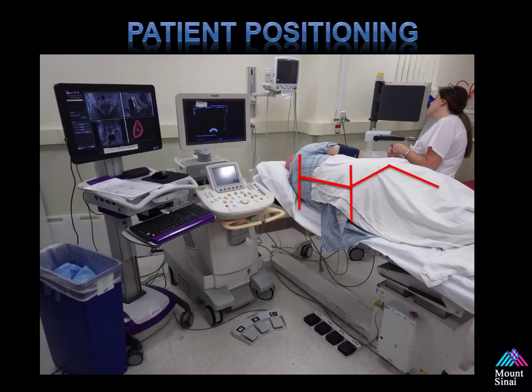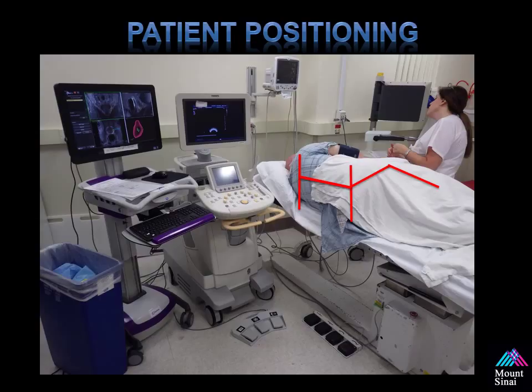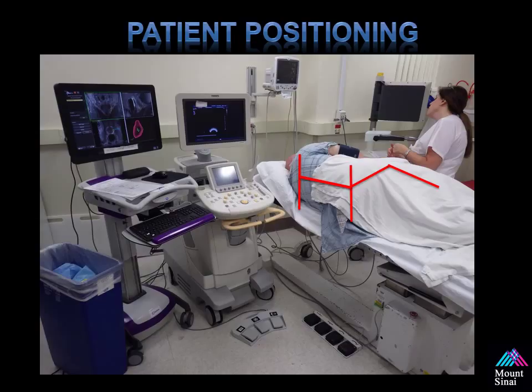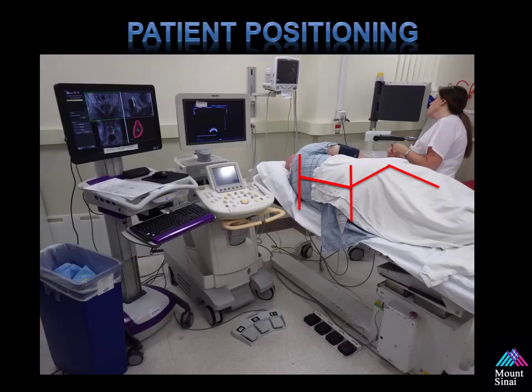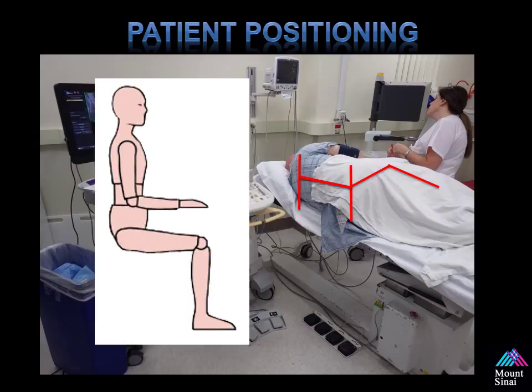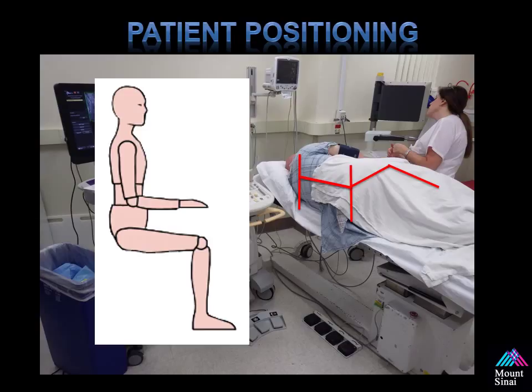Patient positioning and setup is always important. The patient is placed in the left lateral decubitus position. Notice how the shoulders, hips, and knees are all squared up. This allows for easy orientation and the machine seems to function better when you're not adjusting for a secondary rotation of the patient. The first is the ultrasound machine next to the patient — I typically place it here because I use the high-resolution ultrasound to evaluate the prostate during the procedure. My technician works on the left, which is the Uronav device seen here.